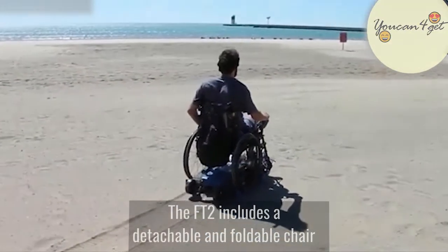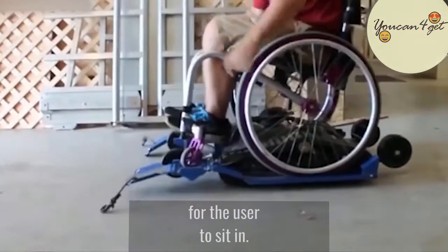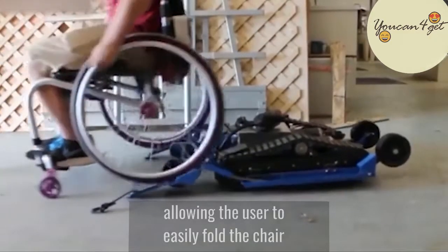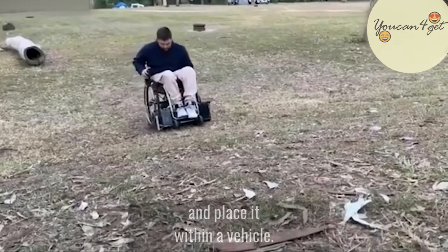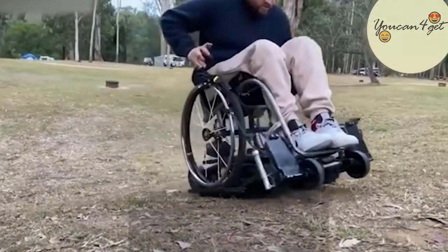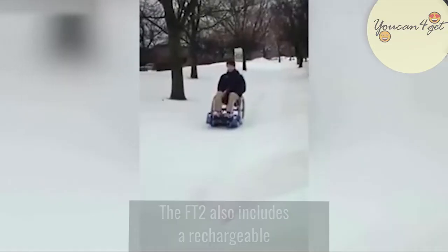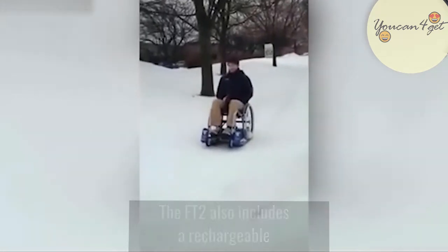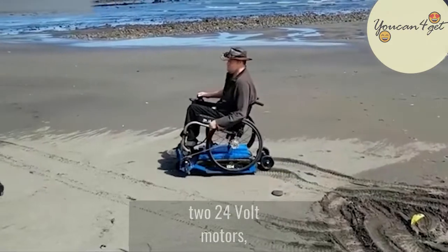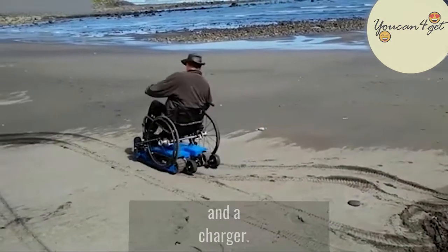The FT2 includes a detachable and foldable chair for the user to sit in. This chair is easy to remove, allowing the user to easily fold the chair and place it within a vehicle. The FT2 also includes a rechargeable 24-volt lithium-ion battery, two 24-volt motors, a handheld joystick, and a charger.